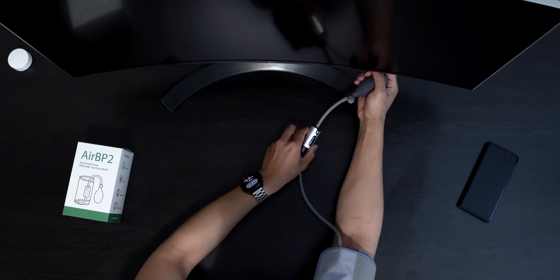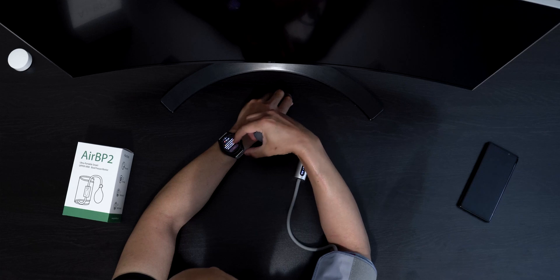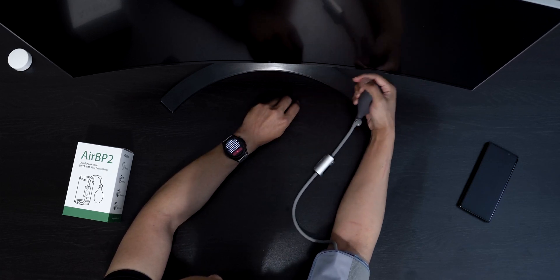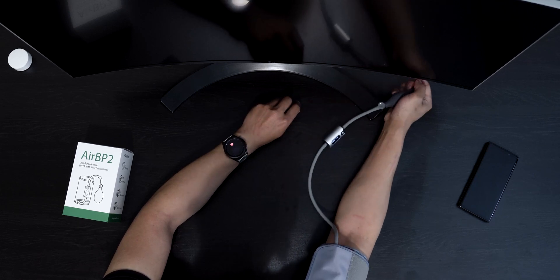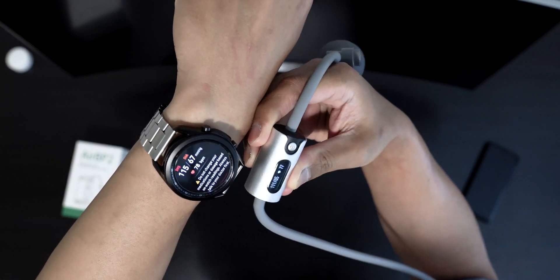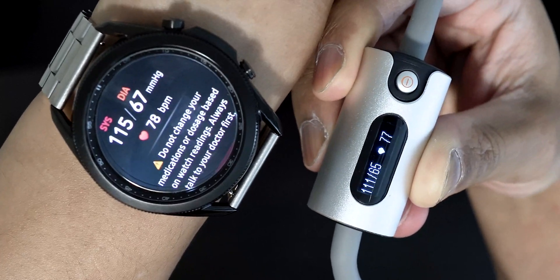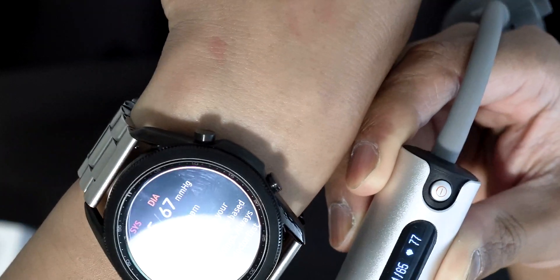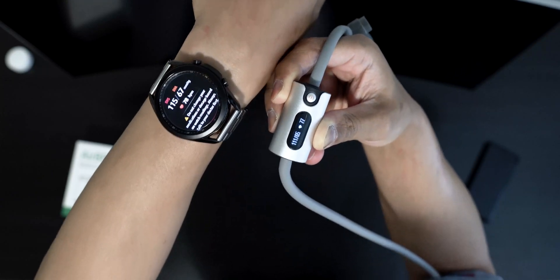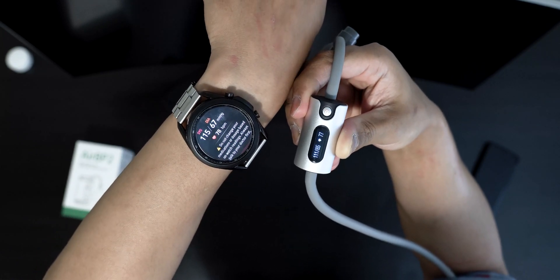It's getting tighter and tighter on my arm — starting to hurt. Let's do this one more time. This one is off as well. So if you're relying on the watch app to check your blood pressure, you might have to think twice about it. As you can see, it's not really that accurate — not accurate whatsoever.